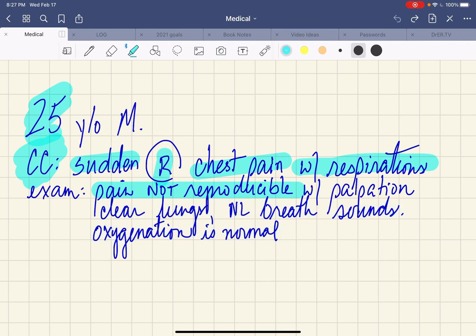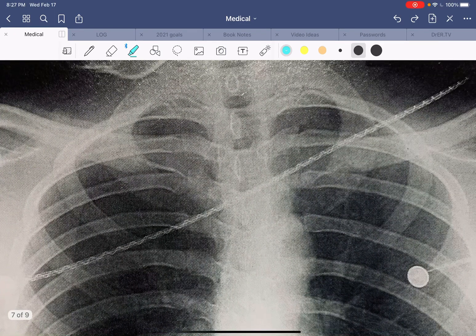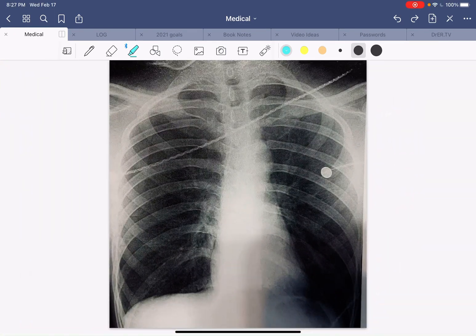So essentially, normal exam, normal vital signs, patient with sudden onset of right-sided chest pain that is pleuritic — in other words, it hurts to take a deep breath. This is the patient's x-ray and it basically looks grossly normal. But we're discussing the case, so there's got to be something on it. Let's do a little analysis. Again, we've done the alignment and penetration with the x-ray.